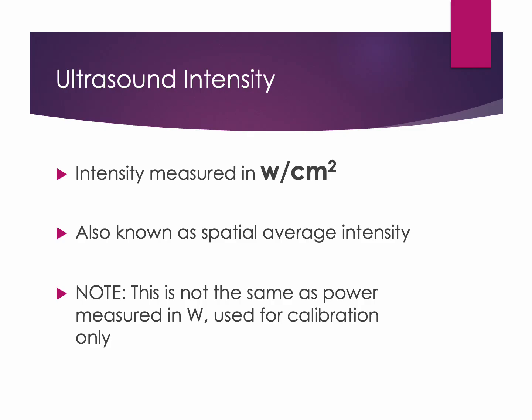Intensity is measured in watts per centimeter squared and represents the amount of energy delivered to the tissue. It's important to note that this is not the same as power, which is measured in watts, which is used for calibration of the machine. Make sure that when you are using the ultrasound machines, that they are in the watts per centimeter squared mode.